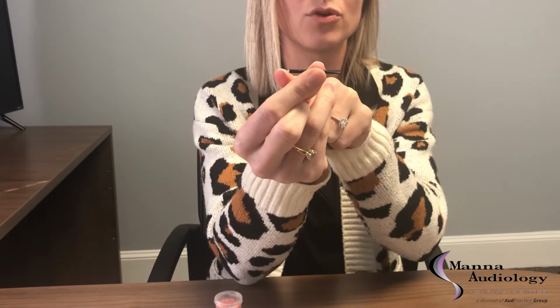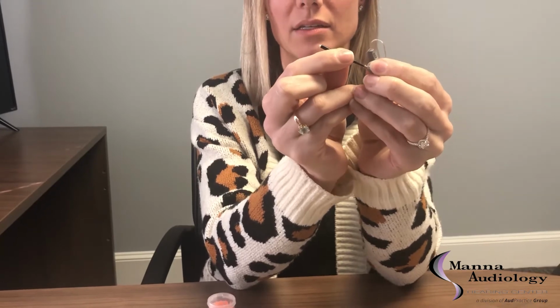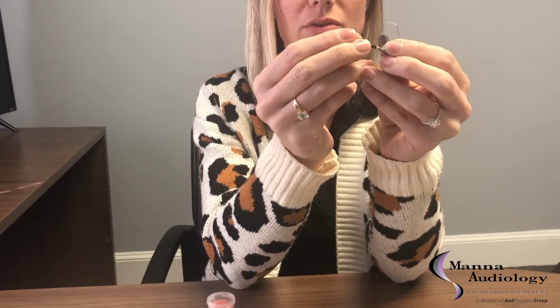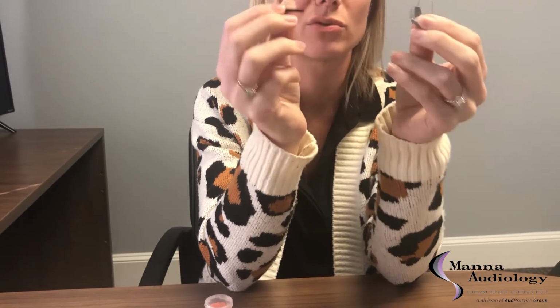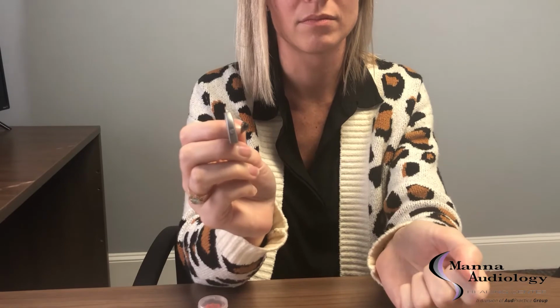The stick, it's empty on one side and a new filter on the other side. And the empty side goes in first, straight in, straight out. Flip the stick around, the new one goes straight in, straight out, no twisting or turning. And then the dome goes right back on there. That's it.